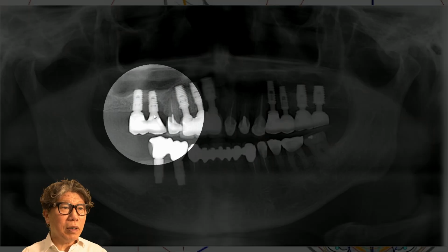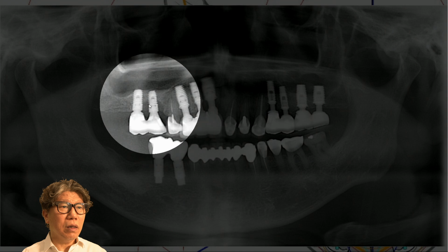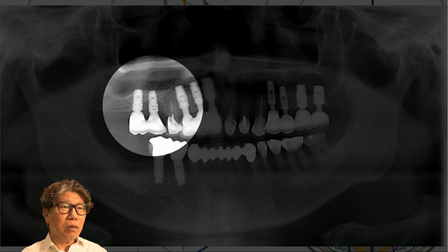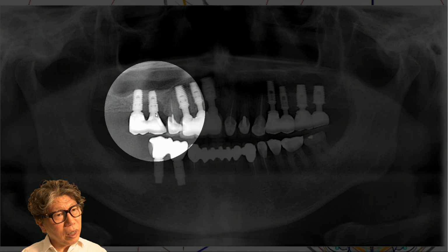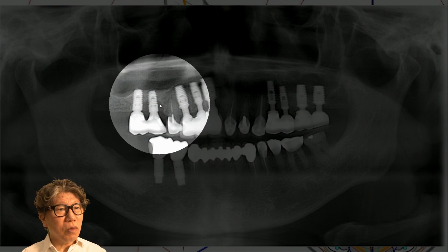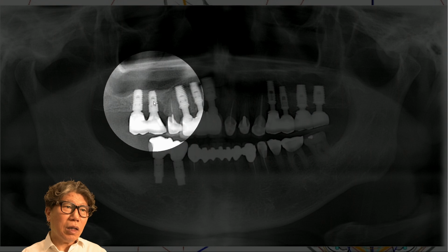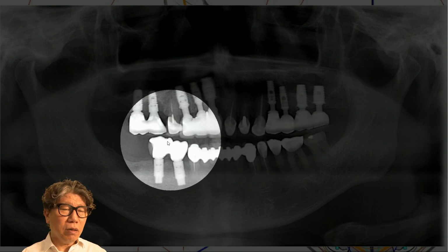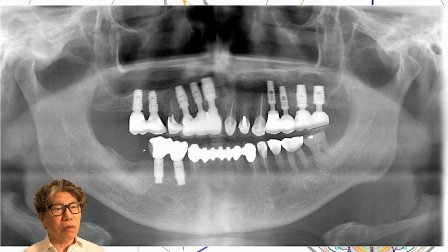If you look here like this, periimplantitis has occurred. Is there a problem with the implant here then? Consider it carefully. Is this a problem of the surface? Or what is the problem? Is the size small? It's not small in size. The situation: if you look, the occlusal plane protruded like this. Why did it become like this?